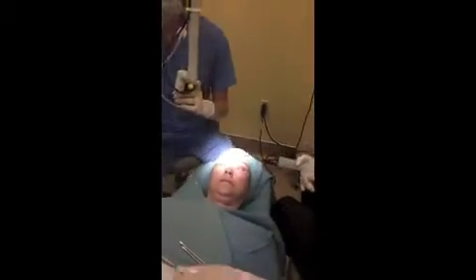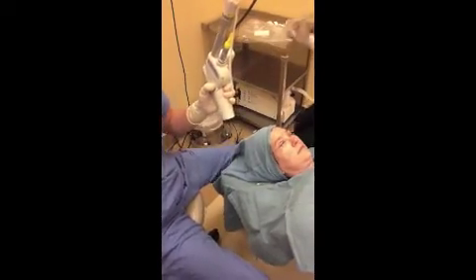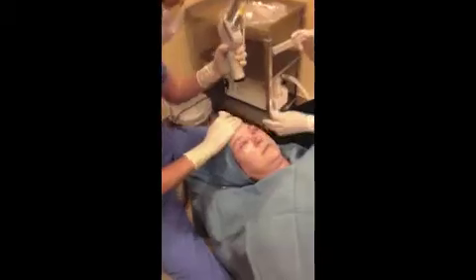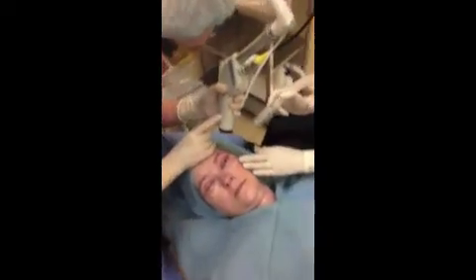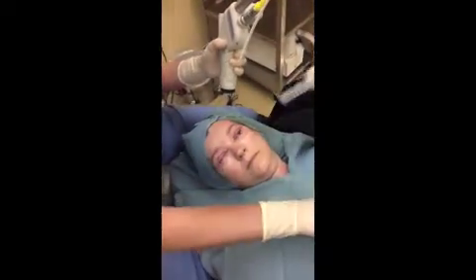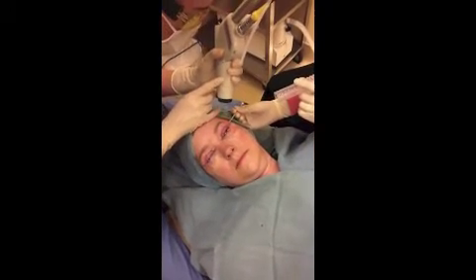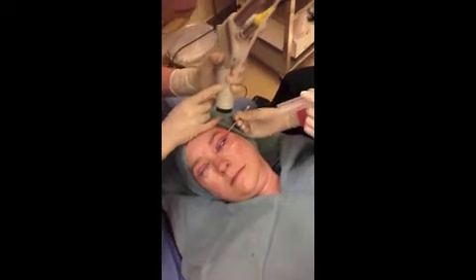Now we'll switch out to the... And it seems to be working. Bring it this way. And then we have to remember to get our seborrheic keratosis.